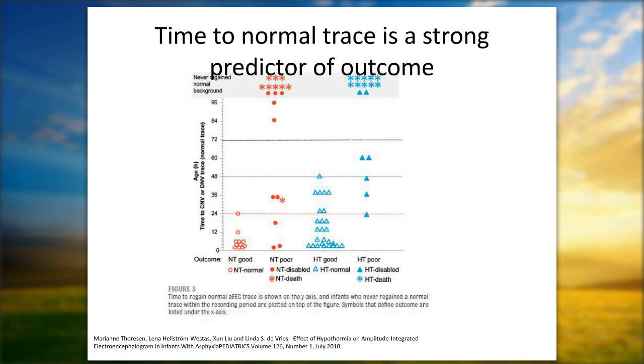Oh, so for your very, very small ones, back to the needle question, Gabriel's commenting that they use the gold caps for the very small preemies, and then needles for maybe the older preterm. Great. Fantastic. Now that I've caught up on your chat, I'm so sorry I missed all that on the side. Yes, the impedance being very low in preemies.